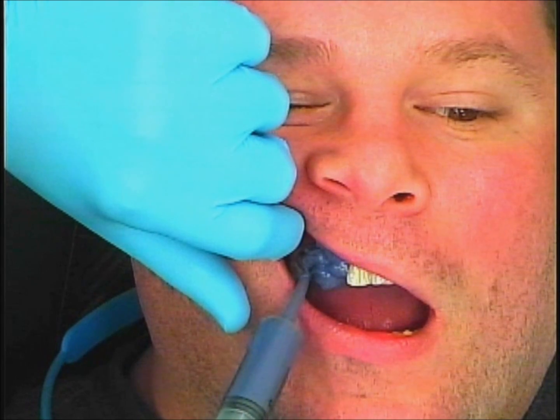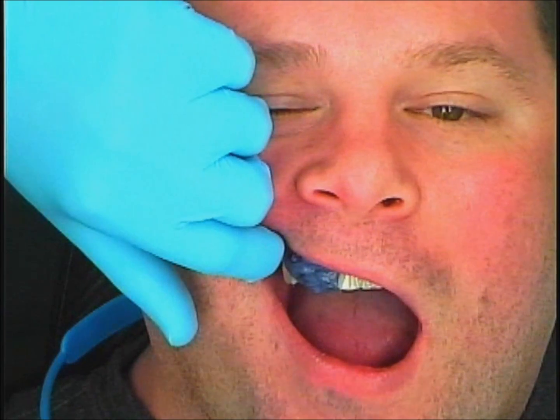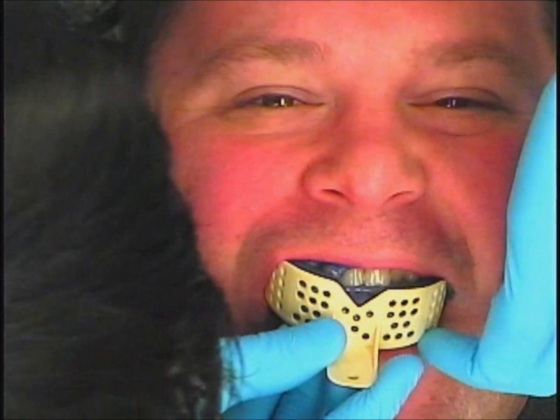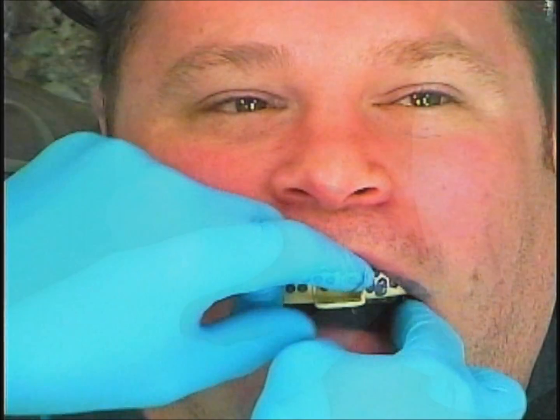I've tried my tray in and now I'm injecting my impression material around the implant, and at the same time I'm filling up the full arch tray. There's no need to modify this tray at all — just a regular stock tray will be inserted, and I make sure that is fully seated and I wait the full amount of time, usually about five minutes or so for that to set.